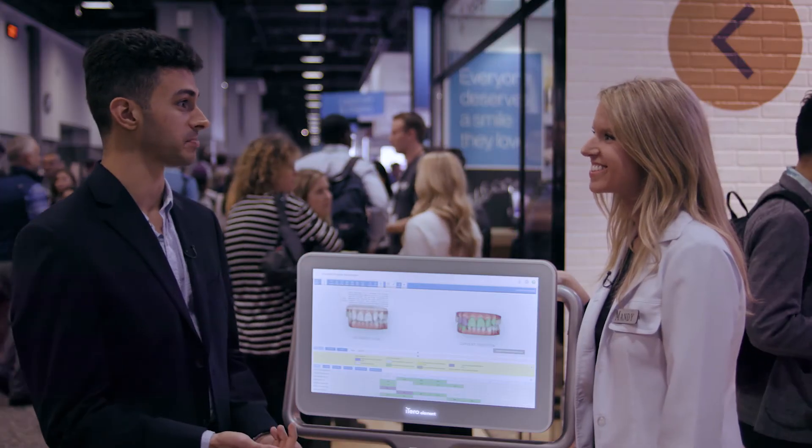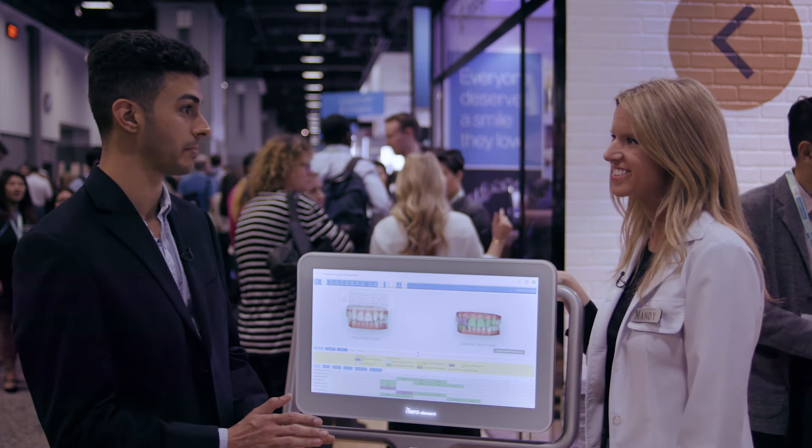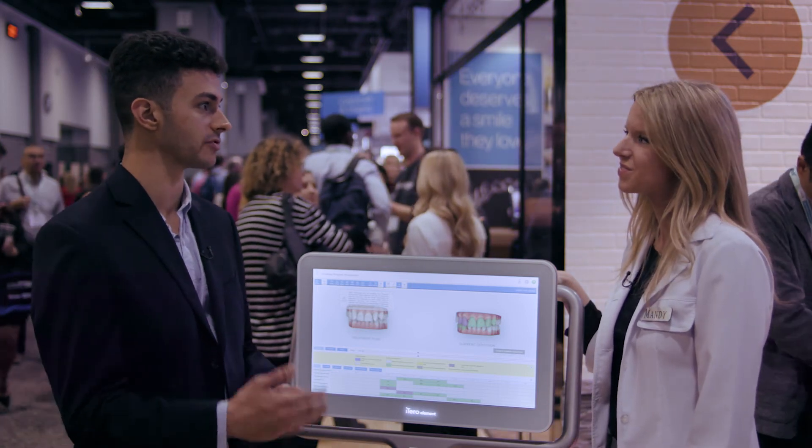Thank you for walking us through the progress assessment. I think it's a great way to show a patient how they're tracking and how they're moving along in their Invisalign treatment.